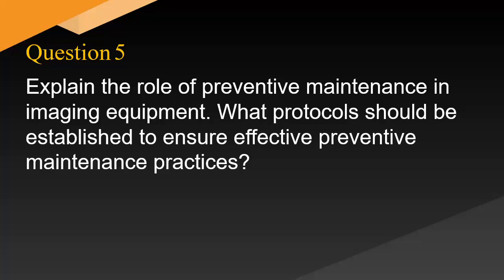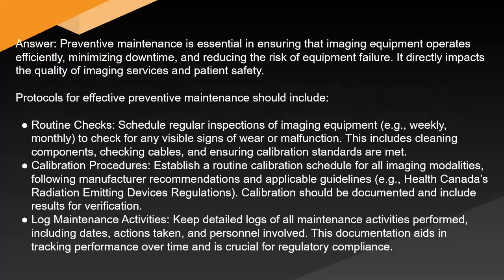Explain the role of preventive maintenance in imaging equipment. What protocols should be established to ensure effective preventive maintenance practices? Answer. Preventive maintenance is essential in ensuring that imaging equipment operates efficiently, minimizing downtime and reducing the risk of equipment failure. It directly impacts the quality of imaging services and patient safety.